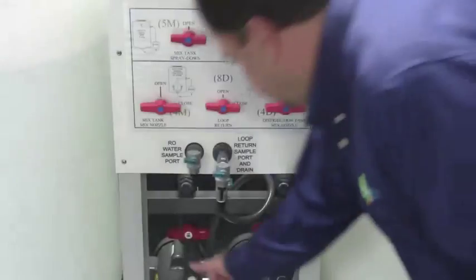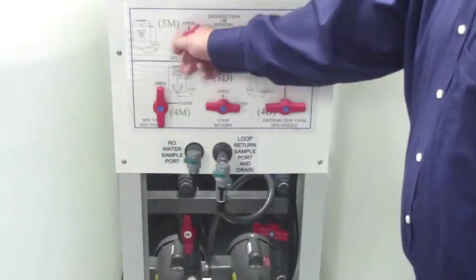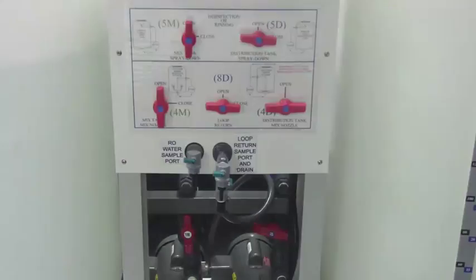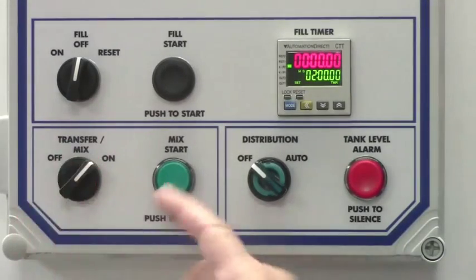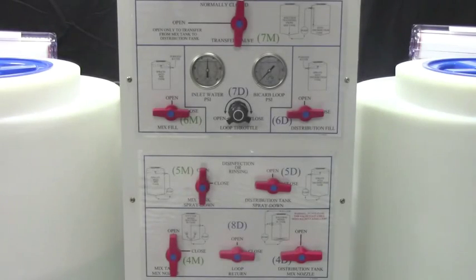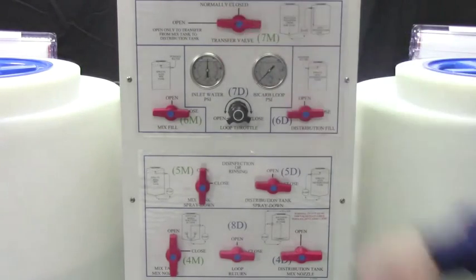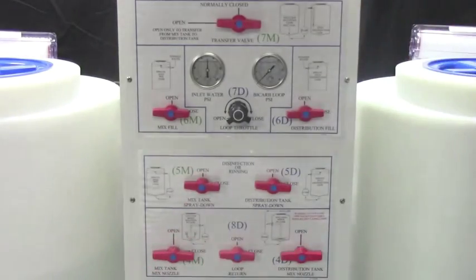Open valves 1M, 4M, and 5M. Turn the transfer mix switch on and push the mix start button. Allow the system to run for 1 to 2 minutes. Then open valve 7M and close 5M and 4M.